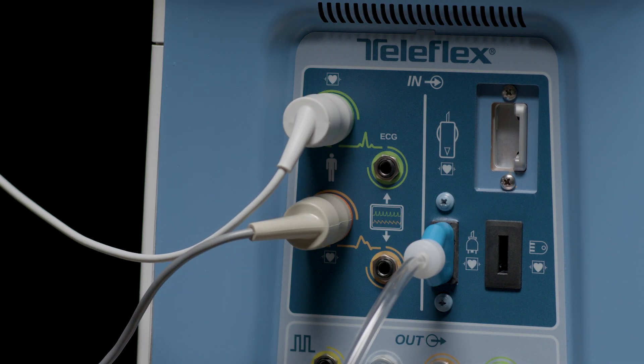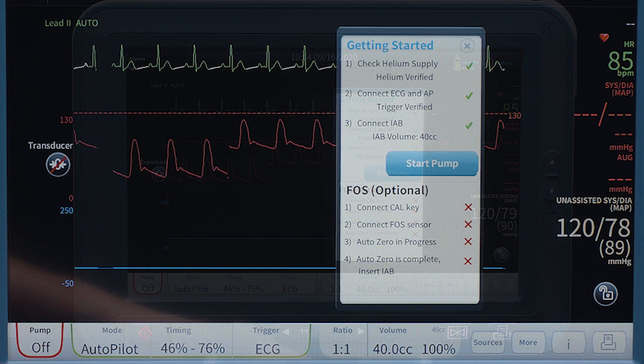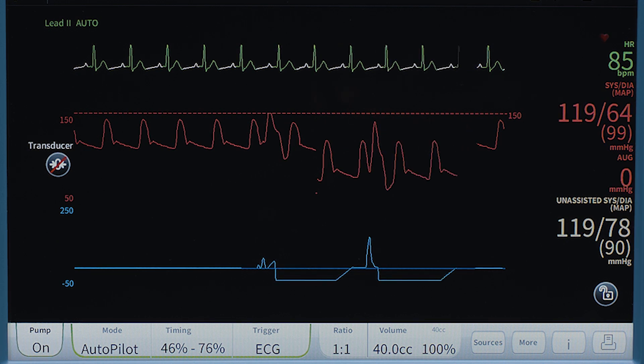Verify that the IAB volume matches the connector, and verify that there are all green checks on the checklist. The start pump on the checklist is now blue. Initiate pumping by pressing start pump on the checklist, and observe the console pumping in a one-to-one assist.